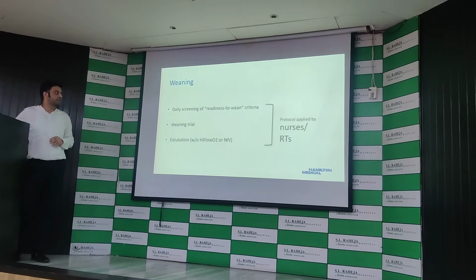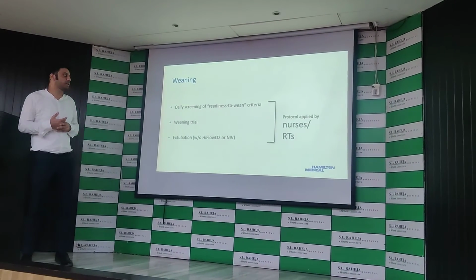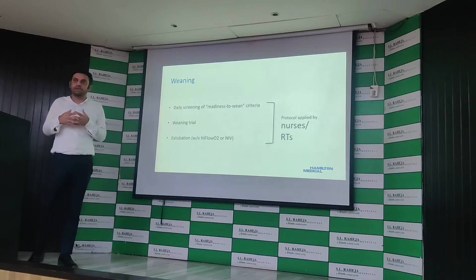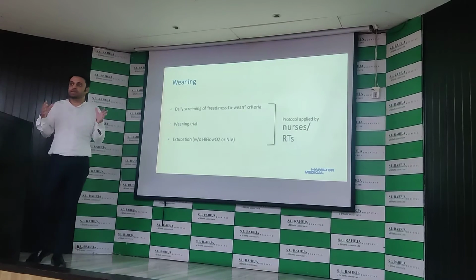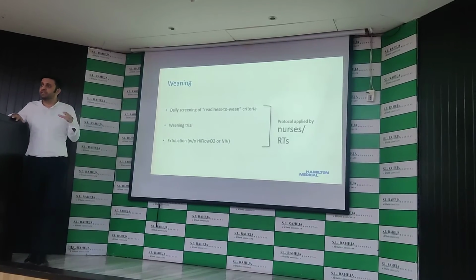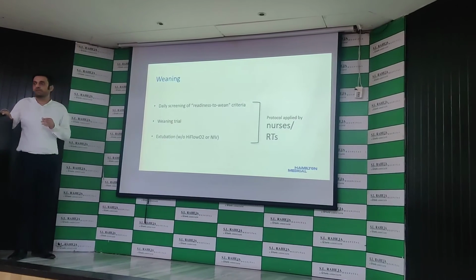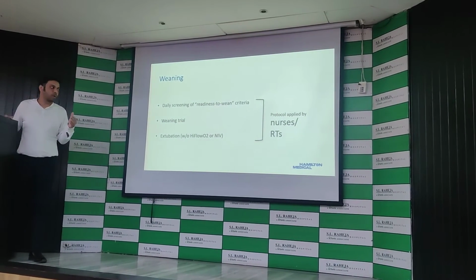Now weaning. When it comes to weaning, we of course have to see the screening and criteria for weaning, and we need to see how ready the patient is to be taken off ventilation. All the other hemodynamic parameters we of course have to observe, as we anyway do, such as the patient's blood pressure, fever and secretions. All that comes additionally, but when it comes to the respiratory part, you will see the spontaneous activity and you will be able to reduce support. So again, daily screening is something we have to do. Then a weaning trial, which includes our SBT, which can be done on the machine, and then extubation to either high flow or NIV.